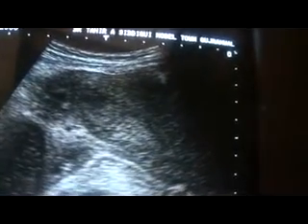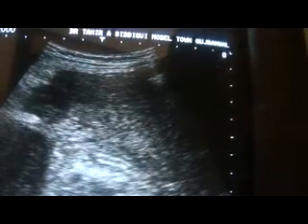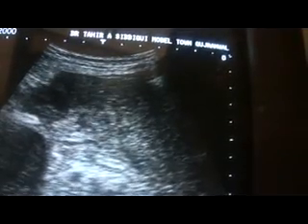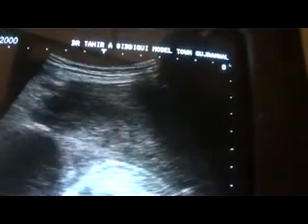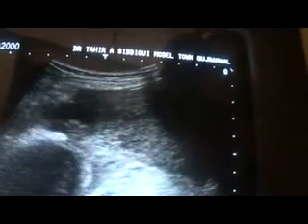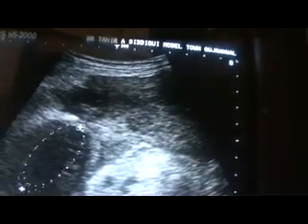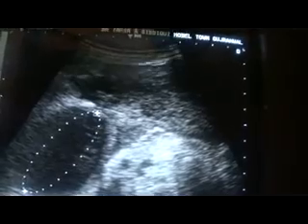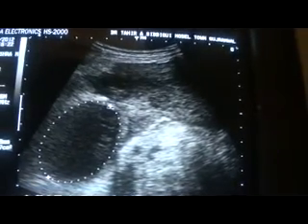In transverse section. However, in longitudinal section, I should have taken the length of the uterus. The uterus measures 10.6 centimeters in length and 4.6 centimeters in anteroposterior diameter. This is normal size. However, the myometrium does show typical postpartum appearance.